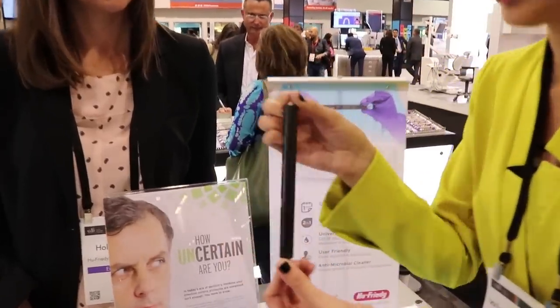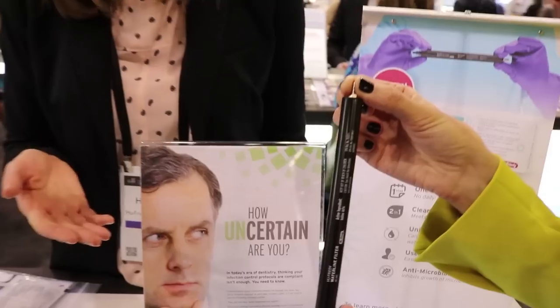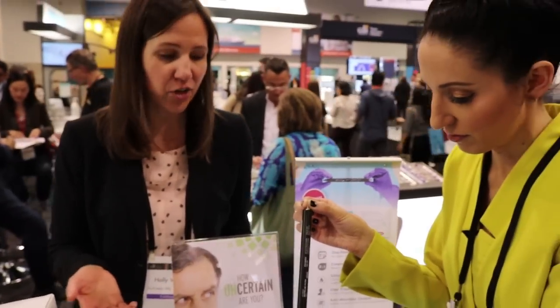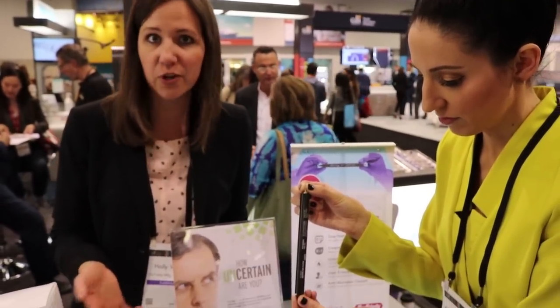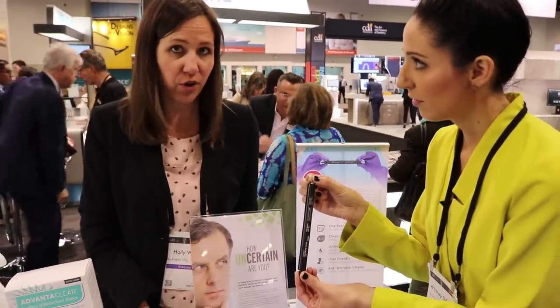I'm excited. Holly's talking about something you can install in line or in the bottle. Once you install it, it's good for one year. So there's no longer any daily, weekly, or monthly protocols — no more adding drops or tablets. The filter does the work for you.